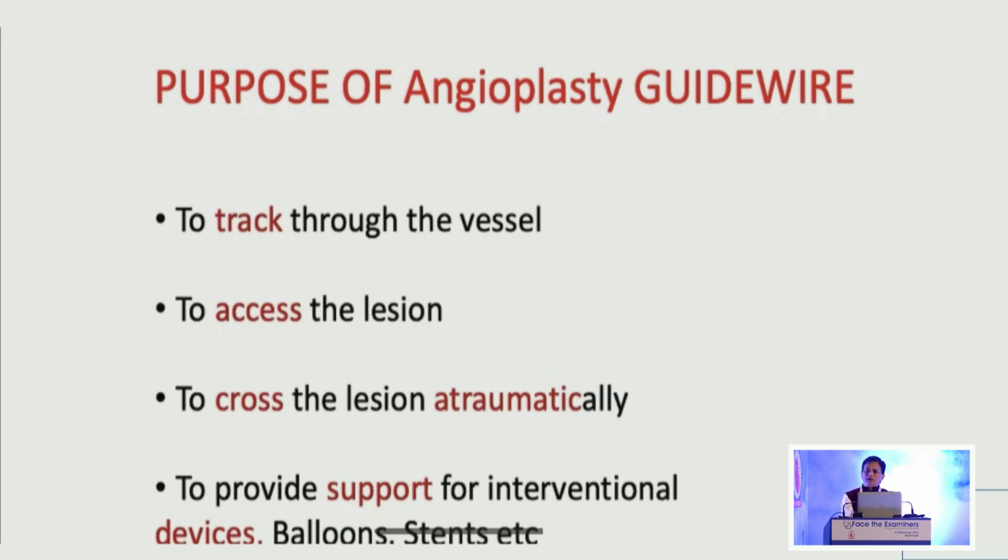I can tell you one thing: the success of an intervention cardiologist depends on how he handles a guide wire. After almost my 35 years of practice, I can say that the moment I see a youngster or any junior or any operator, in 20 seconds you can make out how this operator is, because it all depends on the guide wire. So I request that you pay some little attention and find out what exactly a guide wire is made up of.